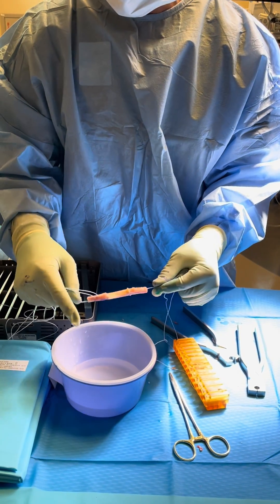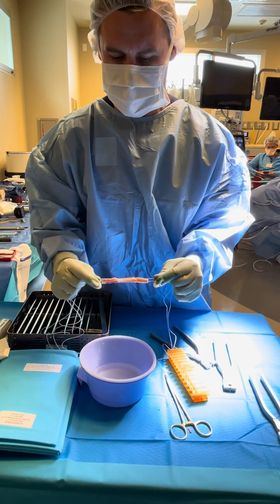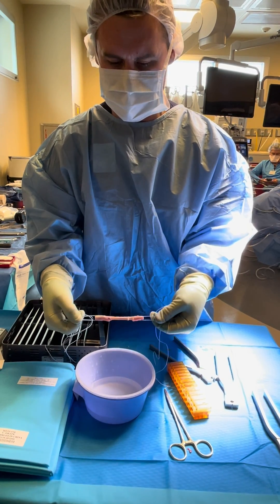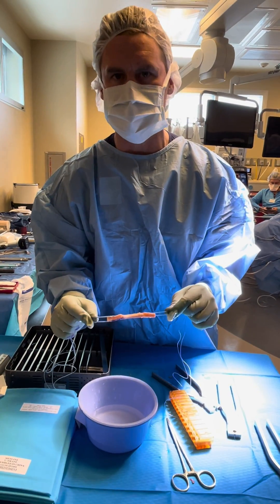I'll leave this to soak in a mixture of this vancomycin solution as part of antibiotic prophylaxis while we prepare the patient's knee before we implant the graft. So this is a bone tendon bone autograft used in ACL reconstruction.